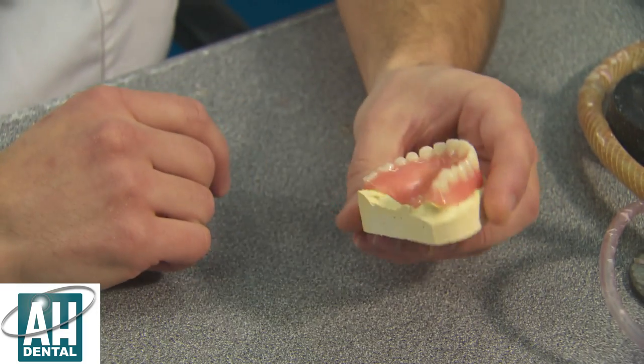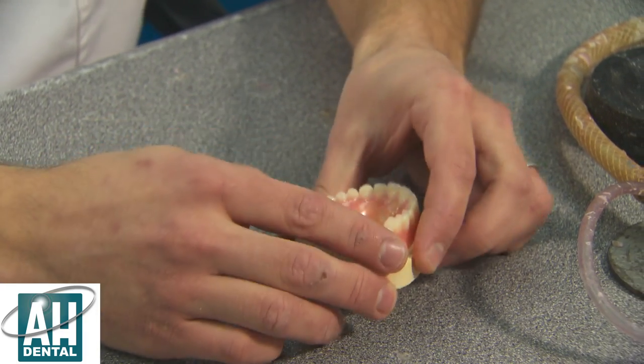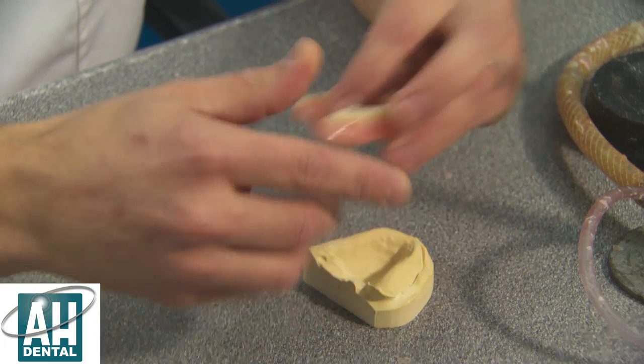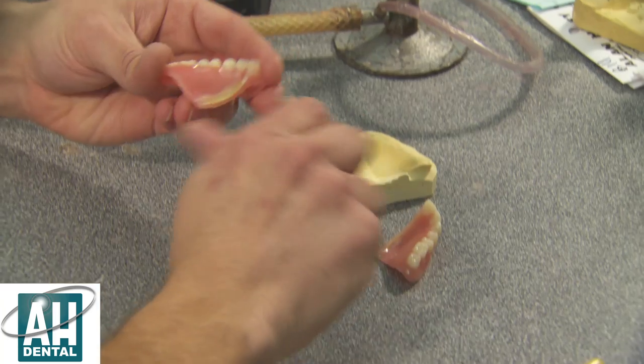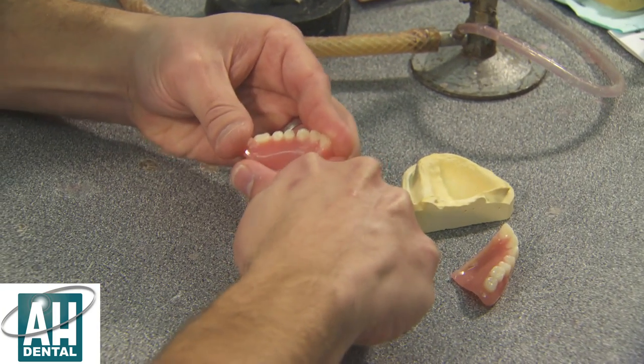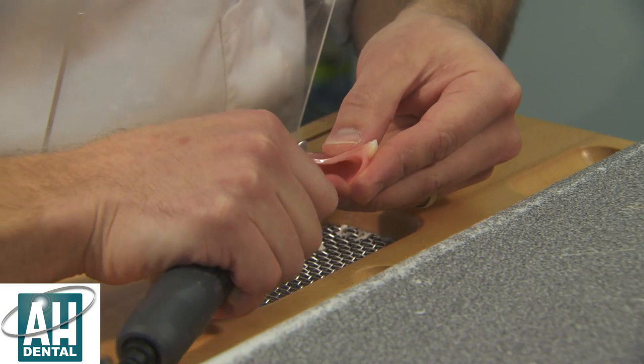Now the model has set, we can remove the wax from the palette and go on to the repair process. To do this we need to break the denture again. We can scrape off the wax out of the palette — it quite simply just chips off. Now we need to trim the groove in the middle of the denture.